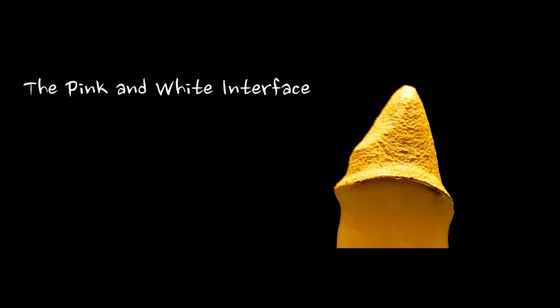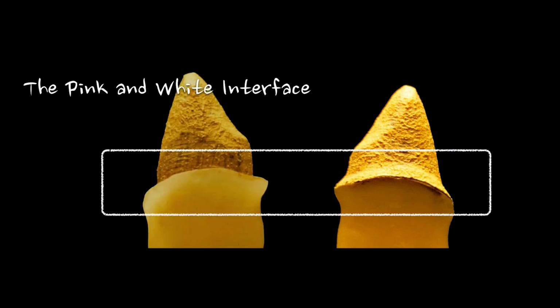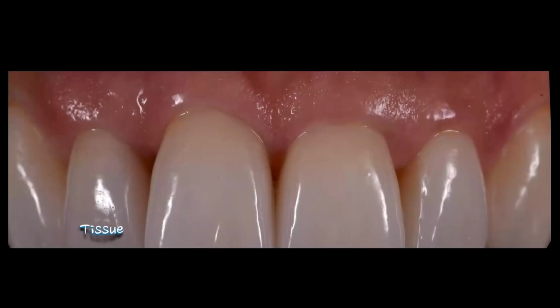So when I used to show it from PFM or zirconia, when we cover those margins, we get that little shadowing in there. When I take away that margin, I tend to get a little bit more light in and out of the tooth. So what I'm trying to really accomplish is picking substructures that I could either use marginal materials with, and that's in metal ceramics and zirconia for sure. And when I get into the lithium disilicates, I can still do it. Most of the time we're working in more monolithic materials, so I'm using secondary materials to do that, like flow dentins and things that give you a little bit more light penetration or light reflection here.